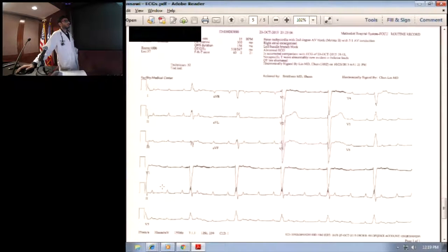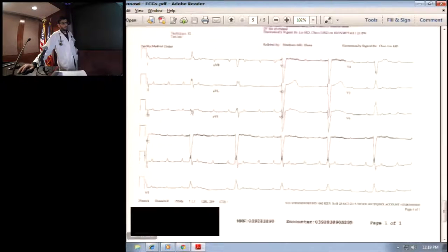So I think the mechanism in these patients can be a tachycardia-dependent, paroxysmal AV block. That's what I'm seeing here, and just to keep in mind, that's the third point, which is the mechanism that we think happened in this patient. Any questions with that? I think you're seeing this.